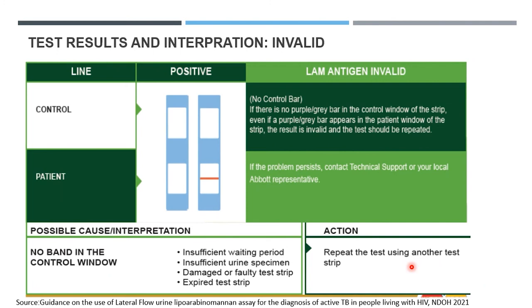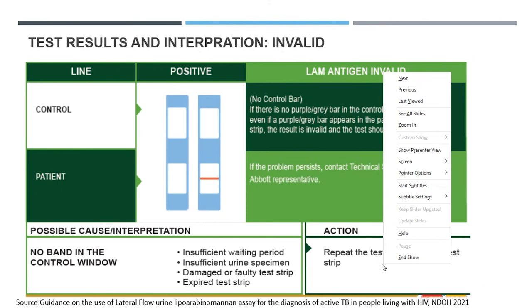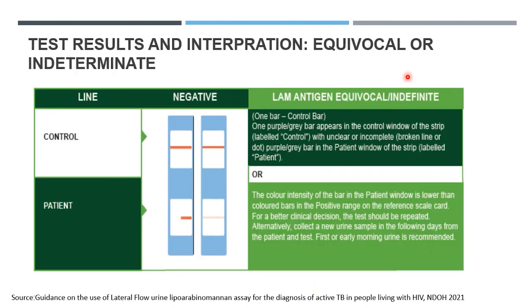And the guidance is that if we repeat the test and we get a similar response, we need to notify our rep about it and use another method alongside our GXP or other in order to be able to get a diagnosis.